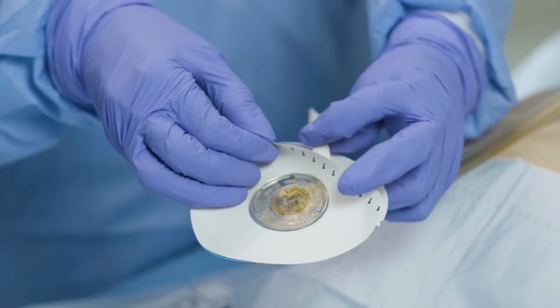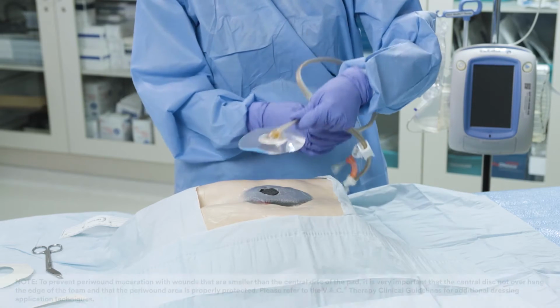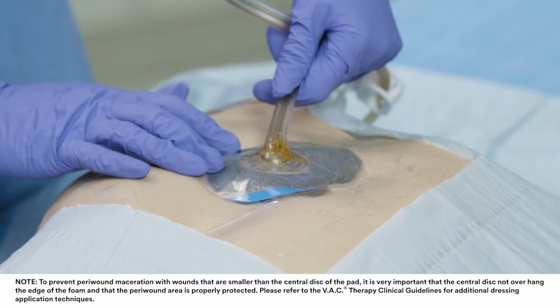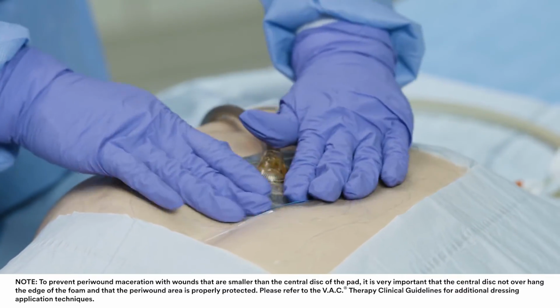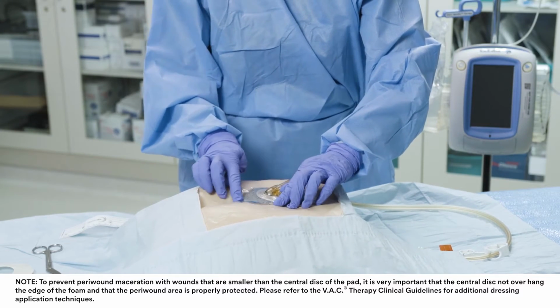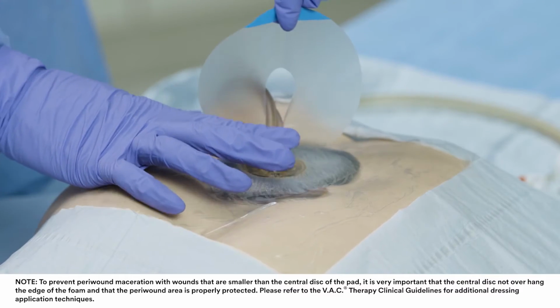Next, remove both backing layers 1 and 2 from the pad to expose the adhesive. Place the pad opening directly over the hole in the drape. Apply gentle pressure on the central disc and outer skirt to ensure complete adhesion of the pad. Pull back on the blue tab to remove the pad stabilization layer.